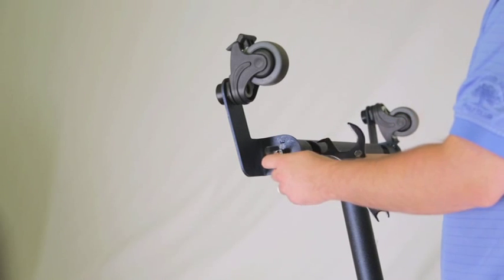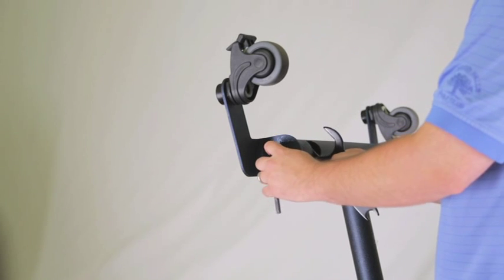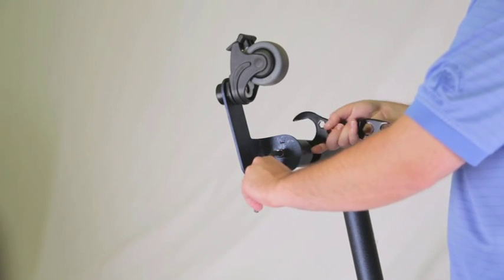Place the nut onto the bolt. Using an allen wrench and the wrench from the tool kit, tighten the bolt and lock nut securely. Do the same on the other side.